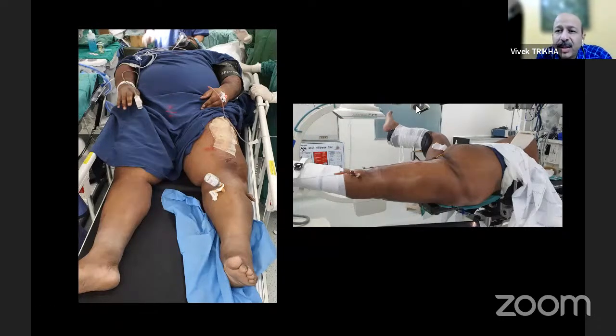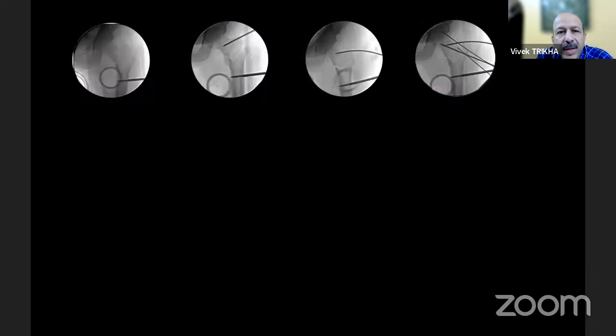We went about doing it the same way as I do all my cases. And what we found out was that we had difficult problems fixing on a fracture table, but here it's the surgeon's preference. The way you have done before, that's what you are going to do. I'll show you his example to tell you how to reduce these fractures.